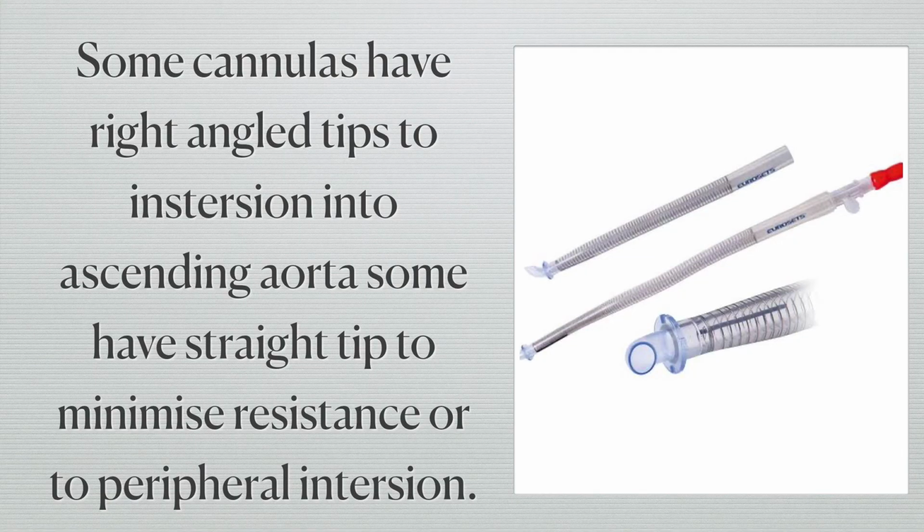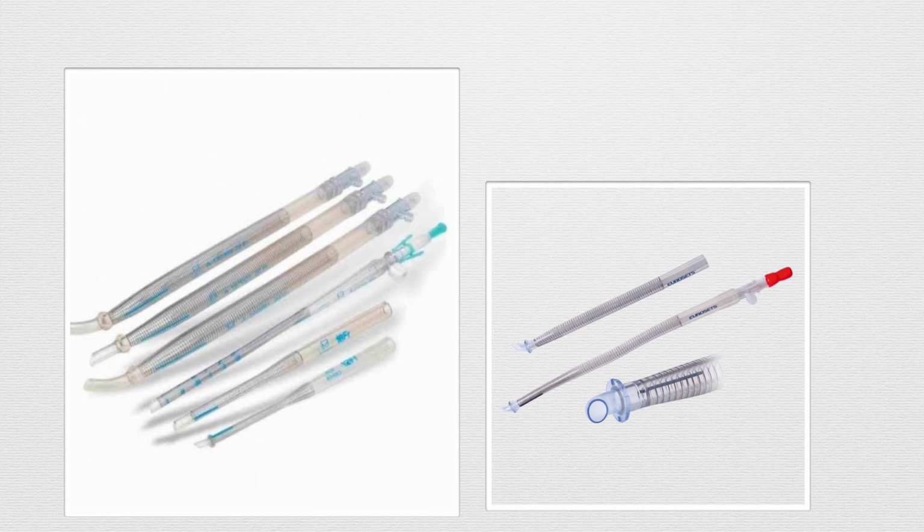Some have a straight tip to minimize resistance or for peripheral insertion. Right angle aortic cannulas are shown in this figure.